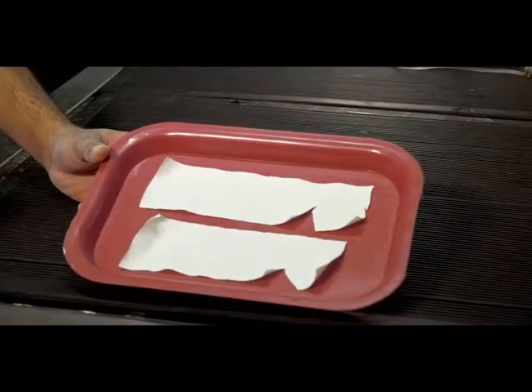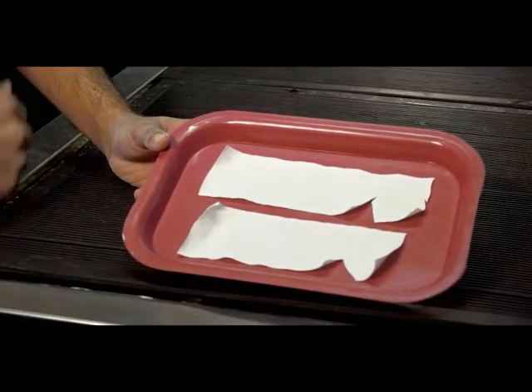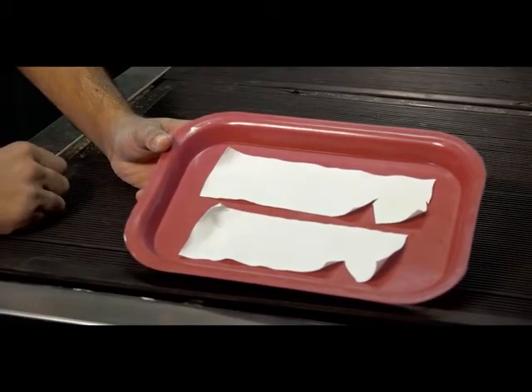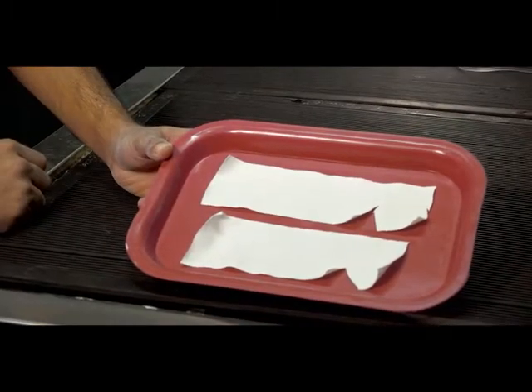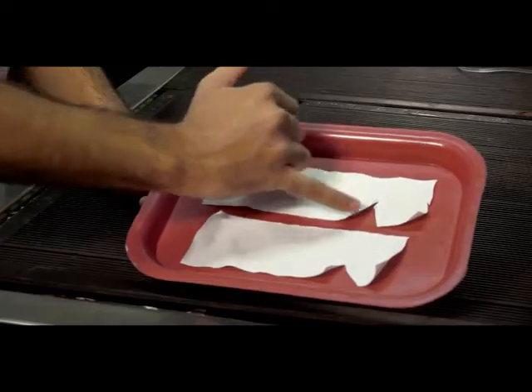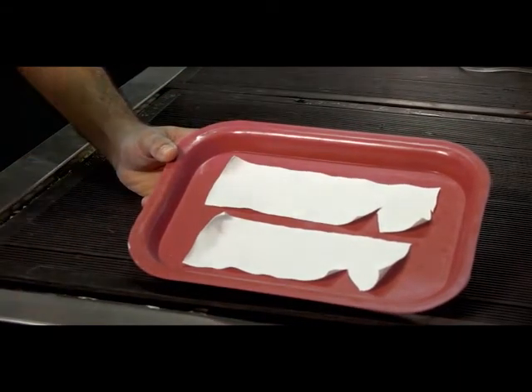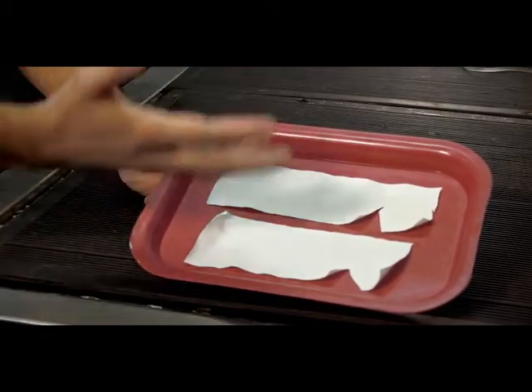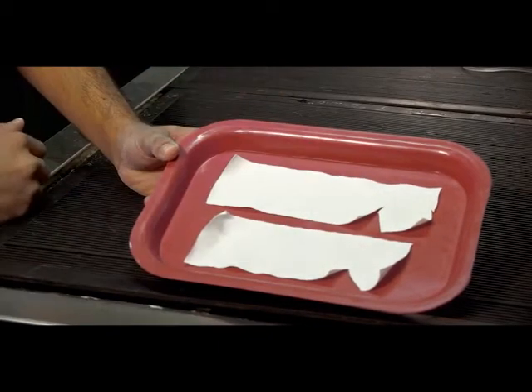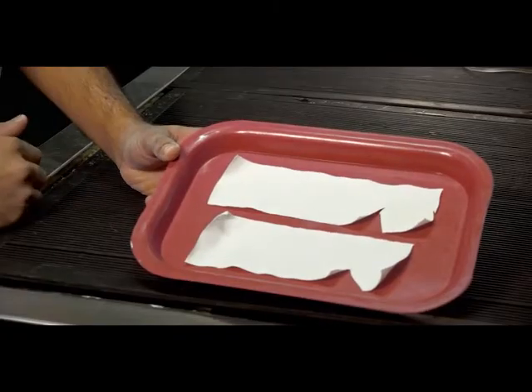So here we have the plasters that we would need to fix the IV cannula in the hand, and we usually have it's usually 6 inches long, and you can select a suitable width. And also it's important that you have a wedge-shaped area removed from the plaster, so it's easy to fix it on either side of the cannula that we're going to place these two plasters. So this is the way you would prepare the two plasters, and later this could be used to fix it in the hand of the dog.